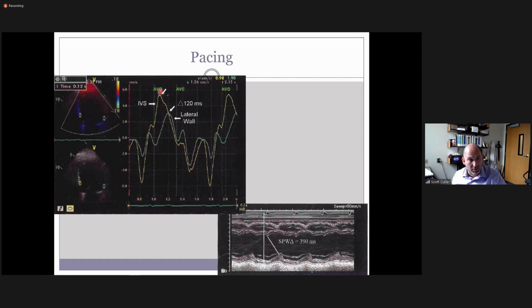So here's the peak of that wall in the septal wall. Here's the peak of the one on the lateral wall. As they time that and pace it correctly and change the pacing, they essentially want walls directly opposite of each other to squeeze at the same time. So these peaks would then line up in one position rather than in two different times. Okay, that would show us that we have synchrony and not dyssynchrony.